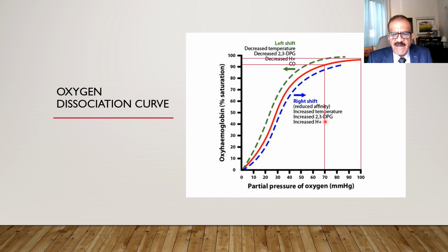So that is why, as I will explain later also, pulse oximetry is not very sensitive to detect mild hypoxemia. Mild hypoxemia is best picked up by arterial blood gases. And here the change is only subtle.